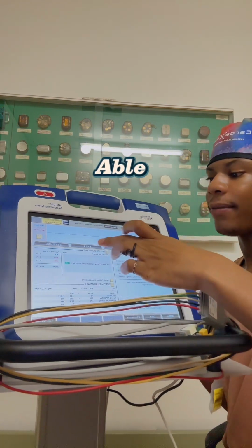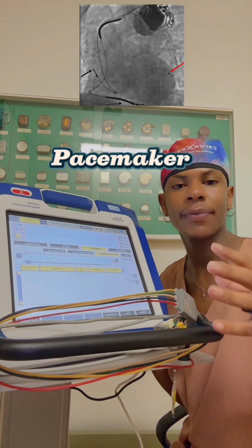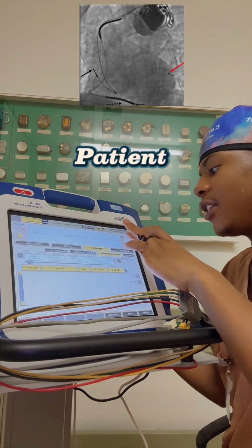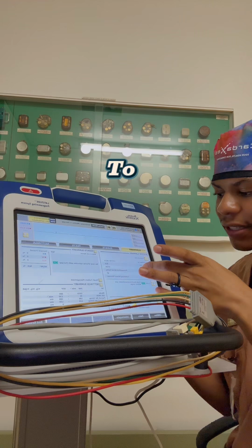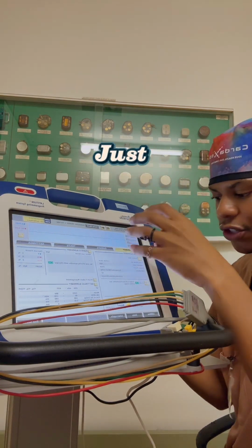You are also able to look at events, which are your recordings, as I stated, since the pacemaker keeps a record of everything that happens to the patient. Then you are also able to see the implant date, the model of the device, and the details of the patient. Everything is stored just here.